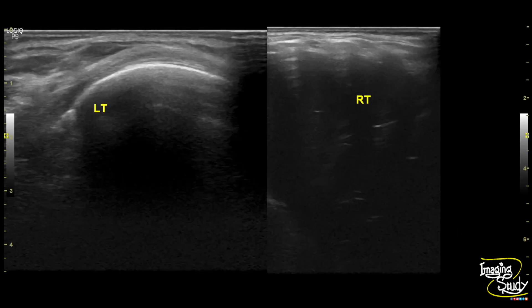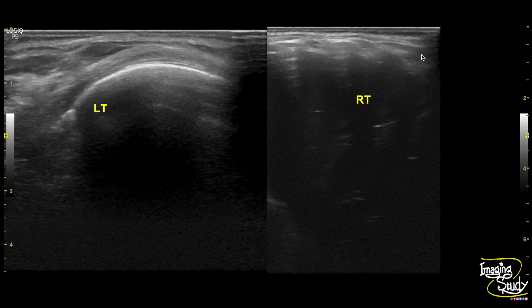Here I have shown the transverse section of the lower chest from the intercostal space. This is the hyperechogenic left visceral pleura which doesn't show any abnormal findings, and on the right you can't see the visceral pleura. This is the parietal pleura. It appears slightly thickened and irregular.